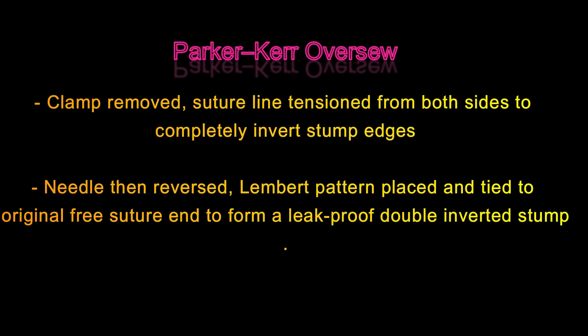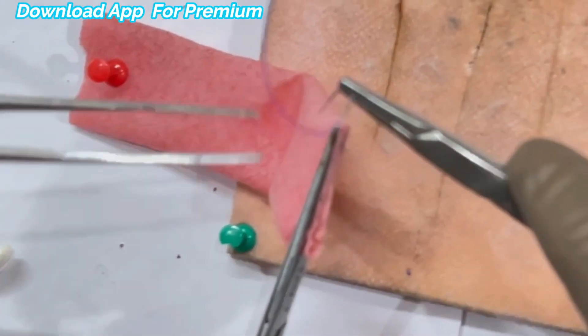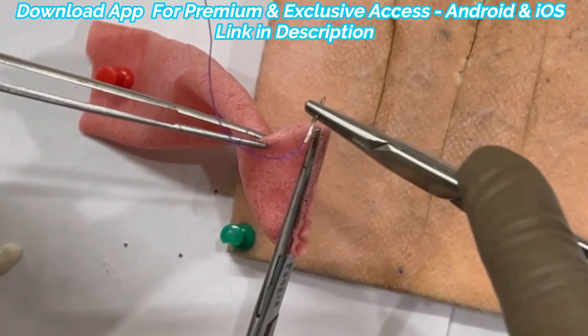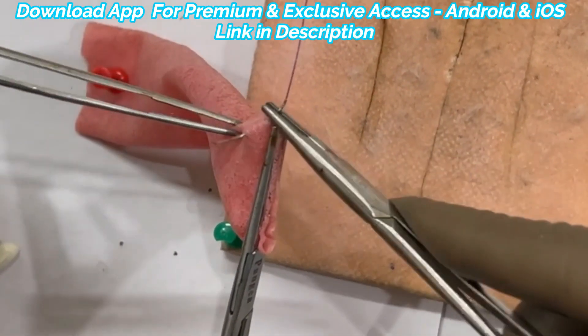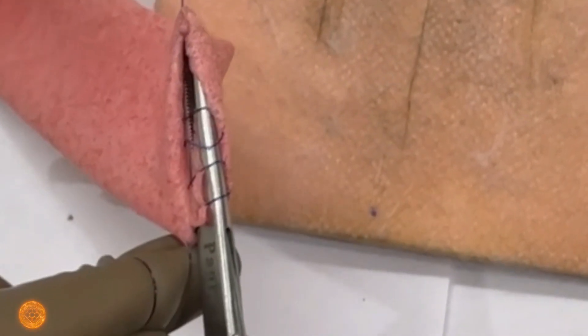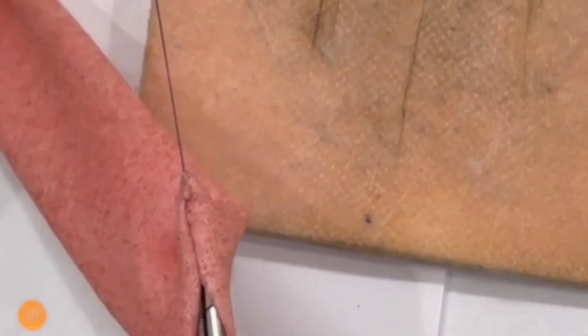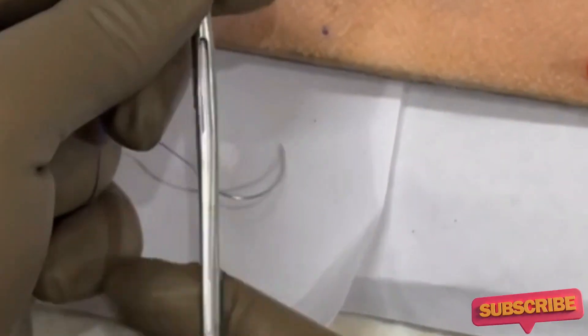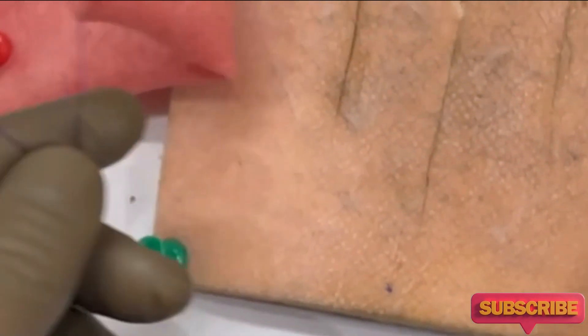When you reach the other end, you start tightening the thread — as you will understand better in the practical demonstration. We start exactly on one side, three to four millimeters from the cut margin. After loosening the clamp and slowly pulling it back, see how beautifully it has inverted.